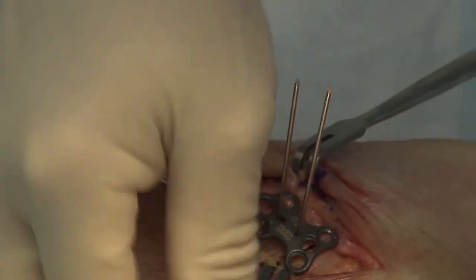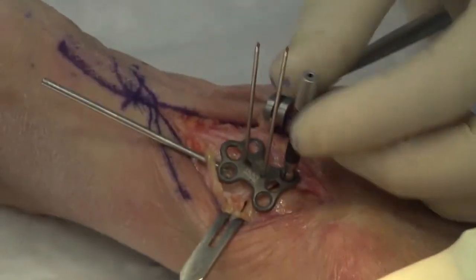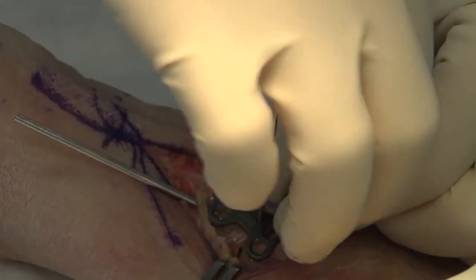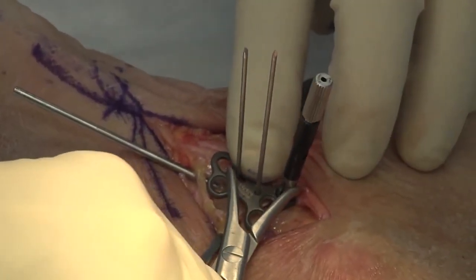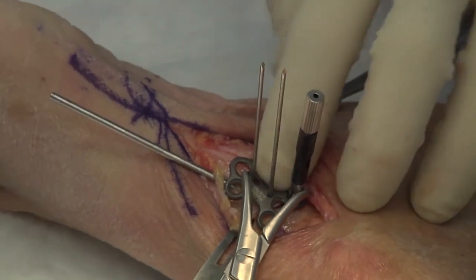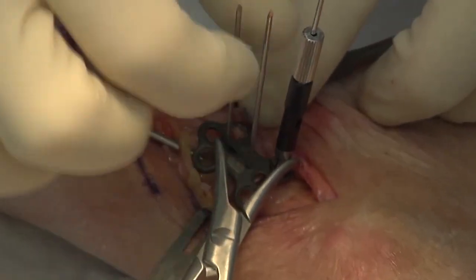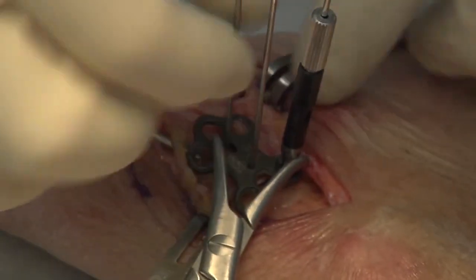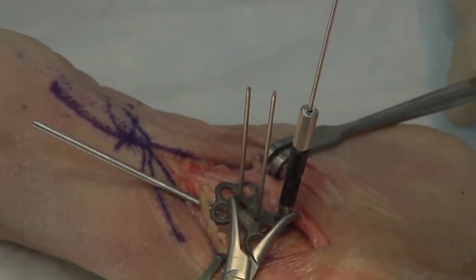We can use a small compressive clamp to squeeze those down. The joystick is locked to the plate — it just gives you a little more leverage to reach down and clamp that joint into compression. The dynamic K-wire position is designed to allow you to compress with those K-wires in place. The joystick also allows placement of an additional K-wire through it, so you have several options of K-wire placement to hold your reduction and compress that joint.